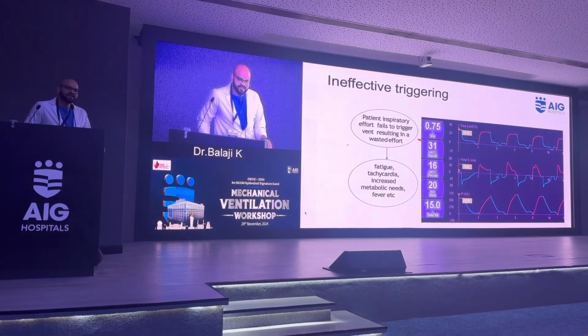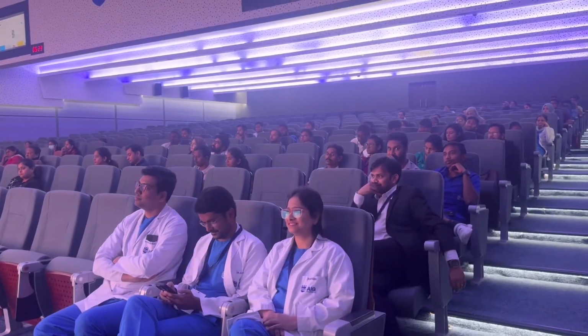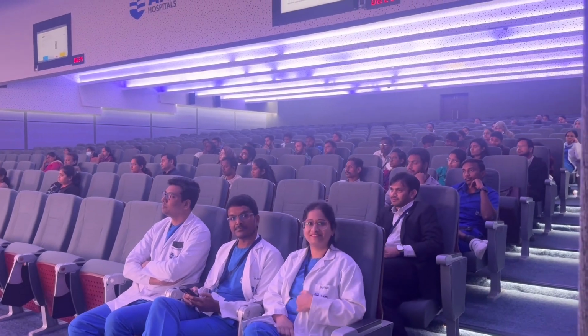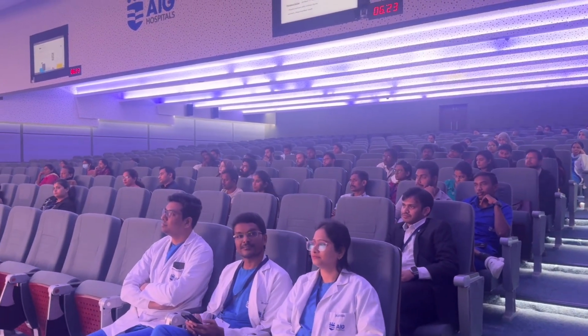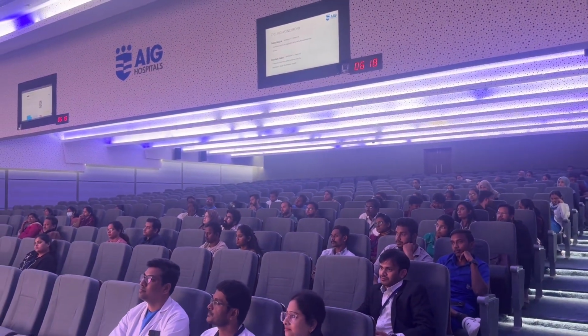The first thing is the trigger threshold. Commonly, as the previous class mentioned, the patient needs more breath, but the ventilator terminates the breath abruptly. So this is premature cycling. This is very common where you are not setting your cycle threshold properly. Normally we set the cycle threshold in a spontaneously breathing patient.